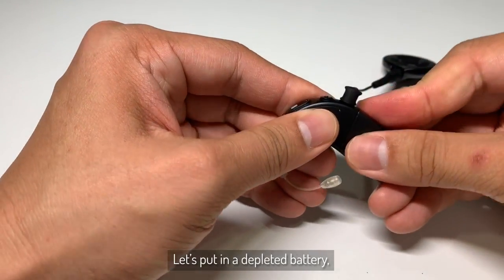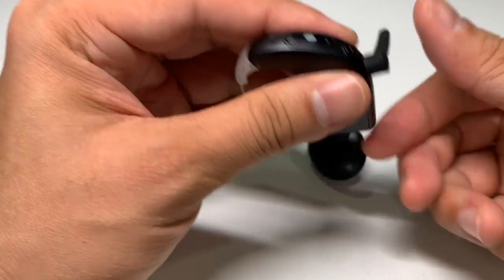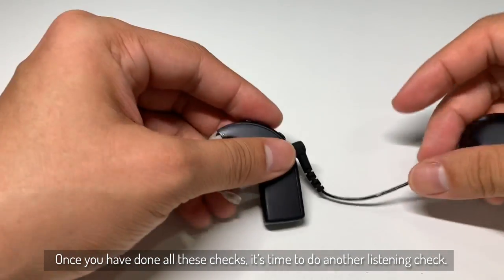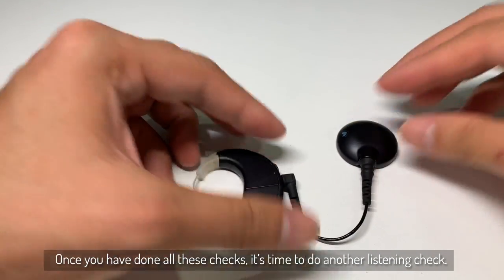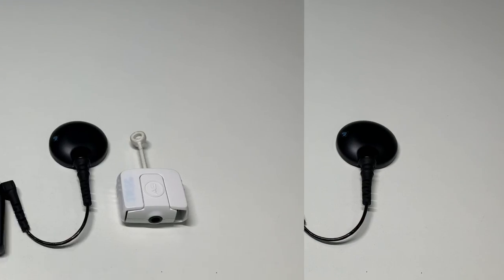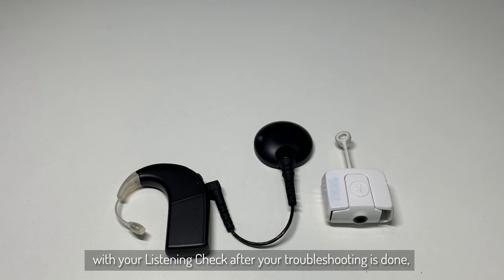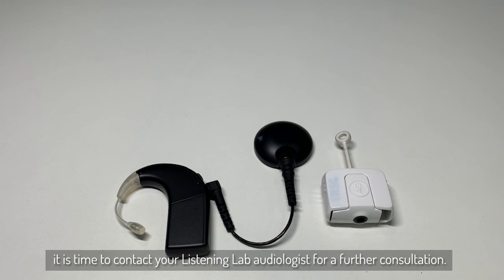Let's put in a depleted battery, and you will see that there is no light flashing. Now once you have done all these checks, it is time to do another listening check. Now if you still hear intermittent sounds with your listening check after the troubleshooting is done, it's time to contact your Listening Lab audiologist for a further consultation.